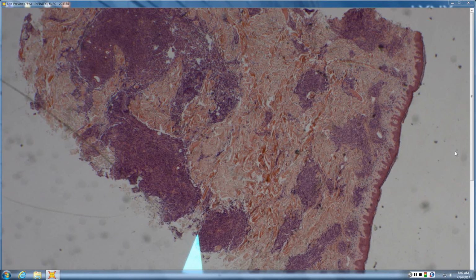How do you know they're benign? They have a perfectly intact CD21 network. Their MIB is 100% positive with the gradient. They normally express BCL6 and CD10, but just restricted to that germinal center like a normal goldfish in a fishbowl.